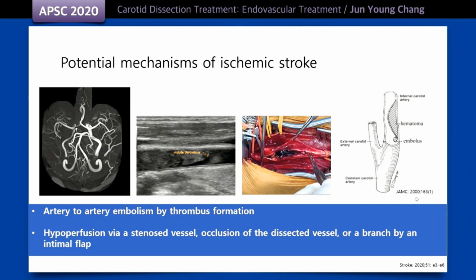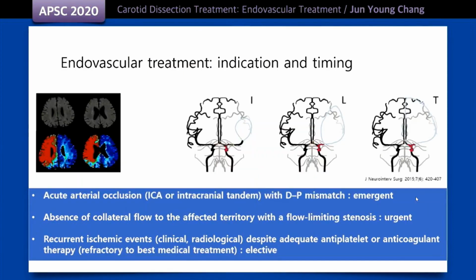A minority of cases are caused by hemodynamic compromise, in which the prognosis is worse. Primary stenting may help improve perfusion by occluding the false lumen and restoring the patency of the parent vessel.